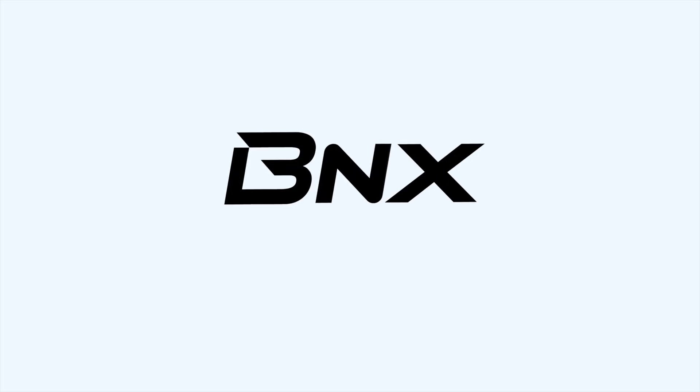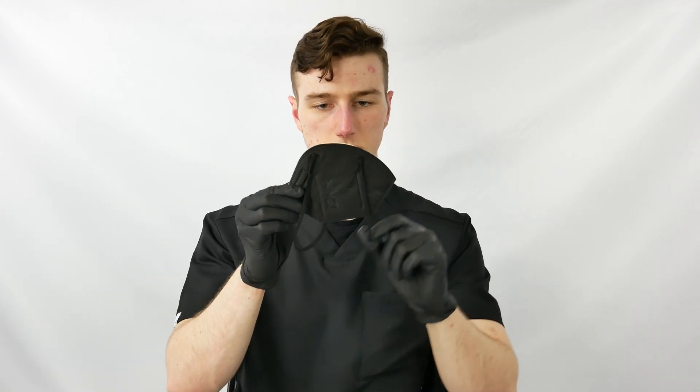Hello and welcome to this BNX tutorial. Hold the mask and pull out the bands. Let the headbands hang outward around the mask.